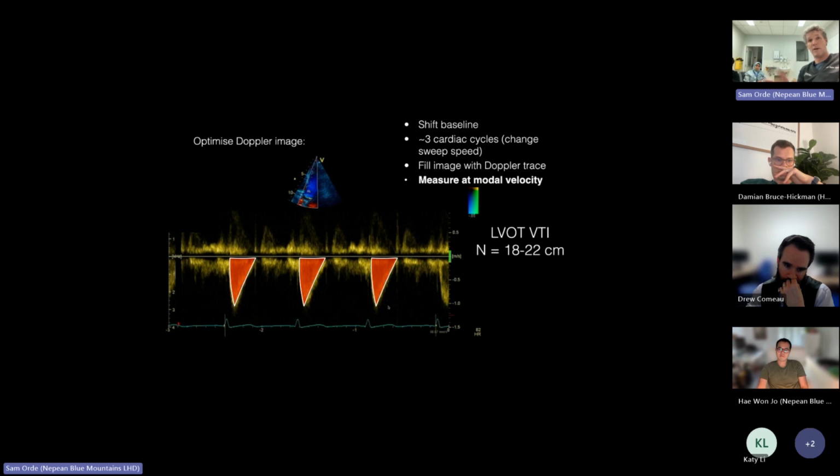So then turn down your gain. More and more in the DDU, where we're showing you pictures, we might ask you to critique the picture. So I think what we're trying to inspire there is to make sure your measurements are correct. I think we've got to measure things correctly, because I'm becoming more and more fond of the idea of using echo as a monitoring tool. So you've got to make sure you're measuring it the same way every time.